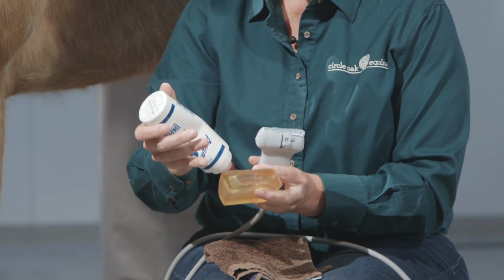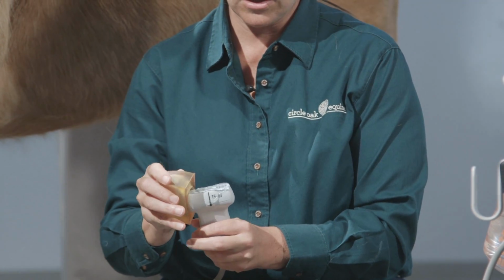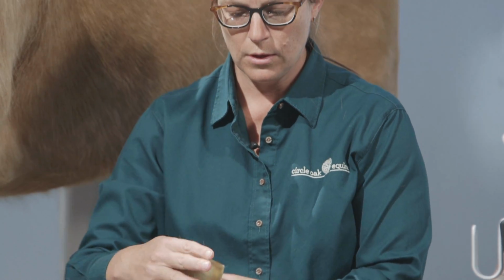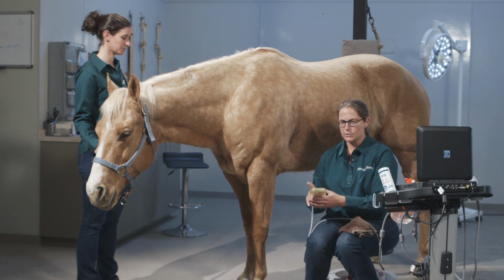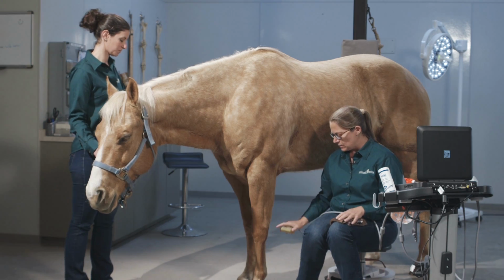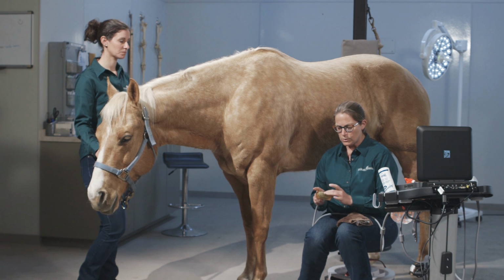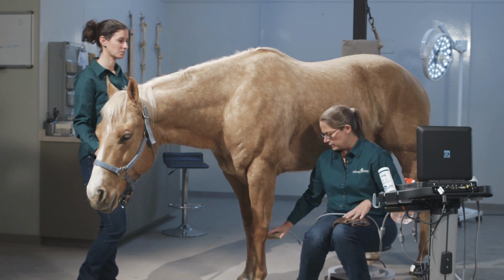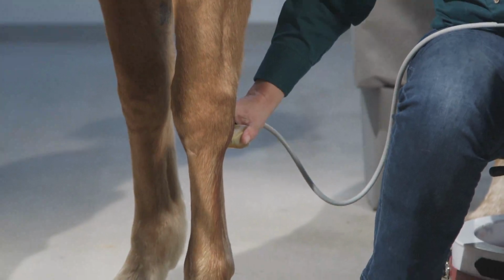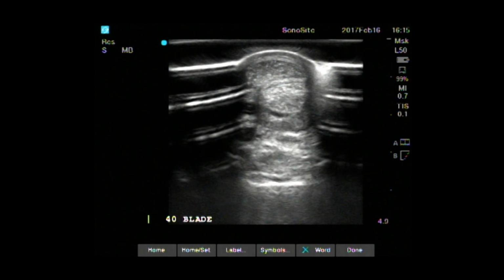The object of interest should be as close to the center of the screen as you can get it. And so a standoff helps you move the superficial structures closer to the center of the screen. And you're going to get your best imaging at the center of your screen. The other reason to use a standoff is because horses' lower limbs don't have a lot of soft tissue. They're very tendinous and bony. And so that means that you're putting a hard structure against a hard structure. And that means that the image that you get is very narrow. You can use a standoff to widen that image field just a little bit by using pressure and having it wrap around the edges of the structure. And so you can get much better image quality, a much wider view of image.